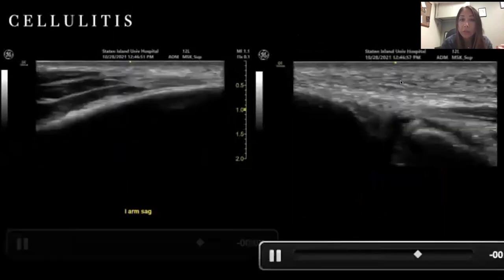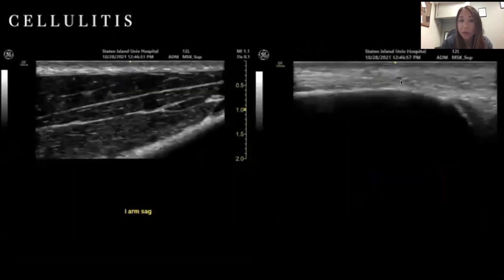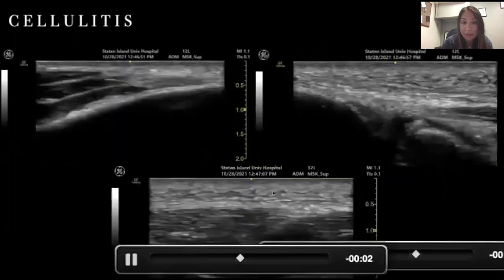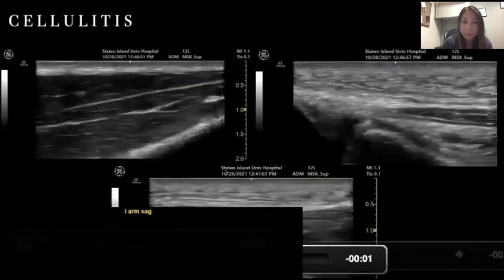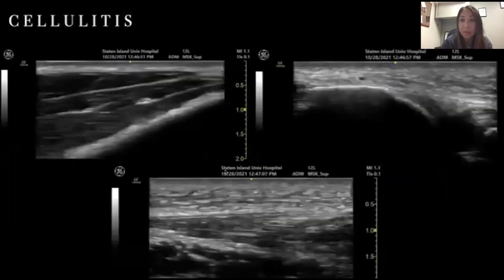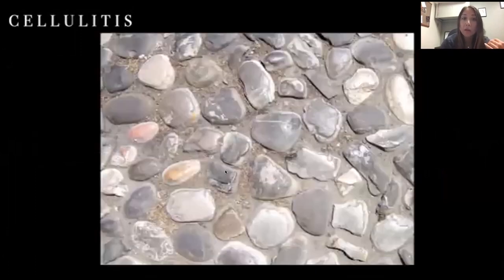You start seeing more cobblestoning or a little bit of fluid and edema. Remember, you'll see a lot of cobblestoning when you have cellulitis.